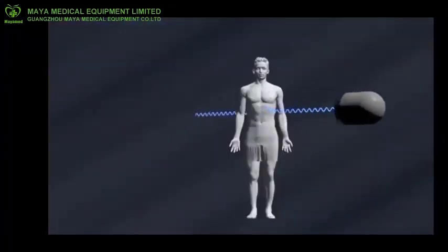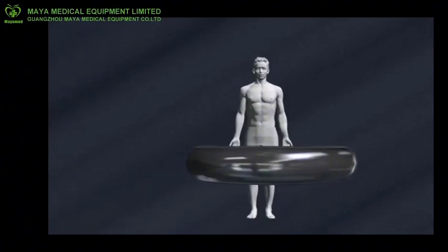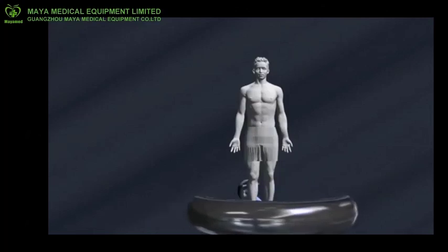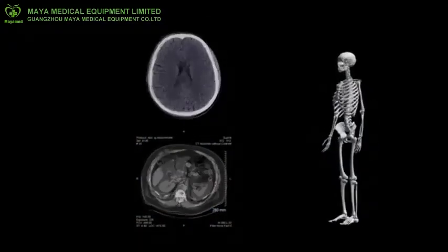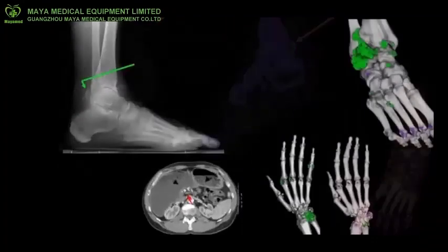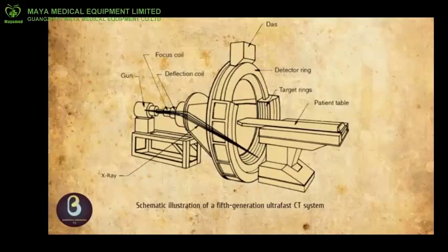The emitted X-rays form a beam which passes through the layer of biological material of thickness delta X. A detector placed at the exit of the sample measures N plus delta N photons, delta N smaller than 0. Attenuation values of the X-ray beam are recorded and data used to build a 3D representation of the scanned object or tissue. There are basically two processes of absorption, the photoelectric effect and the Compton effect. This phenomenon is represented by a single coefficient.